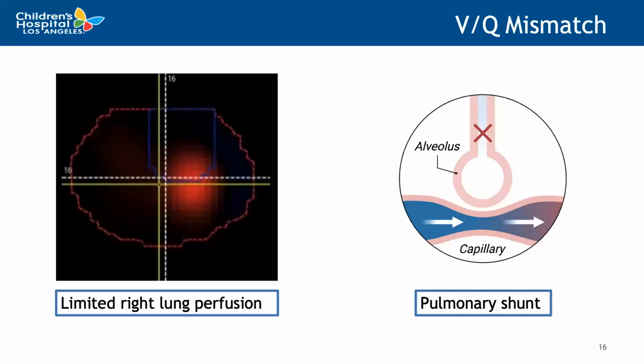As you can see, his perfusion is equally matching his ventilation. So most of, if not all of the perfusion was going to that left lung. And when the patient became desaturated during this episode, it suggested that he was having a worsening VQ mismatch. So now that we blocked off the left lower segment, he was not having any ventilation, but continued to have most of his perfusion going to that area. And so this was worsening a likely already present pulmonary shunt.